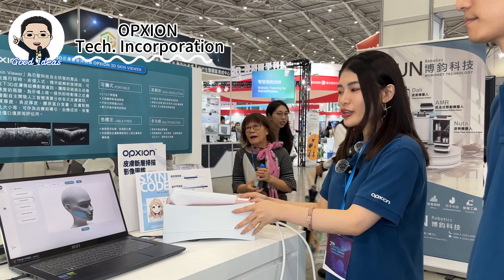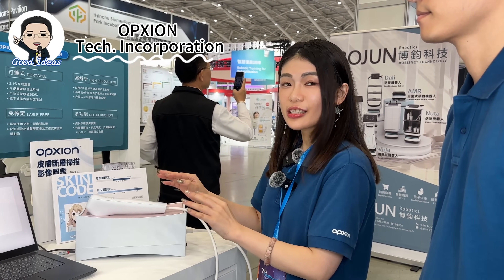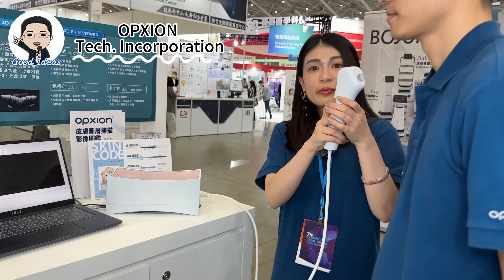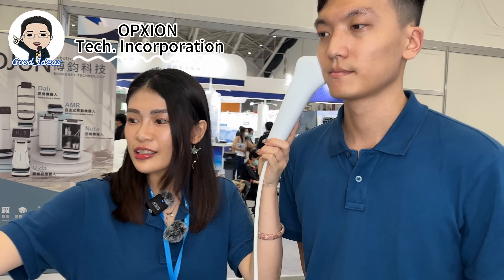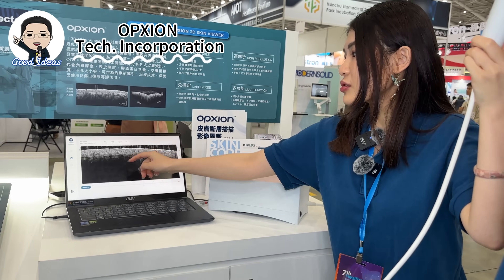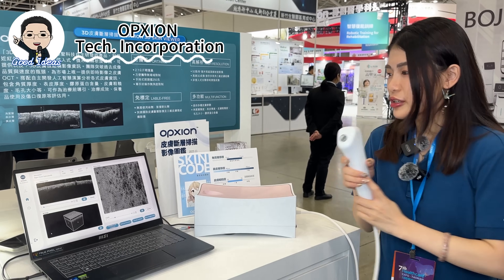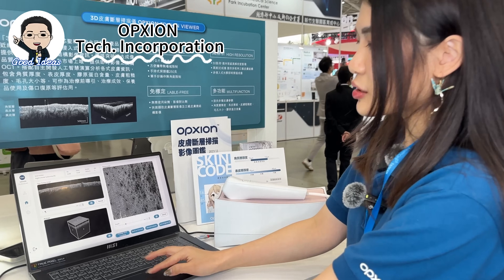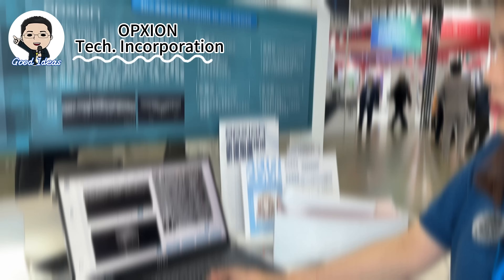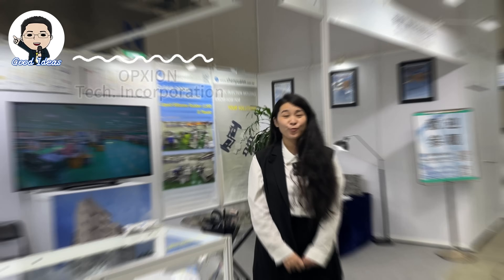Introducing the Options 3D Skin Viewer. This innovative device employs optical coherence tomography technique to capture the detailed skin structure. Think of it like ultrasound but without the need for gel — you can obtain the skin image immediately upon touching the skin. You can witness the epidermis, dermis, and even the vessels. The whole skin scanning process only takes 20 seconds, and afterward you can explore cross-section images at various depths, face images, and even 3D images.